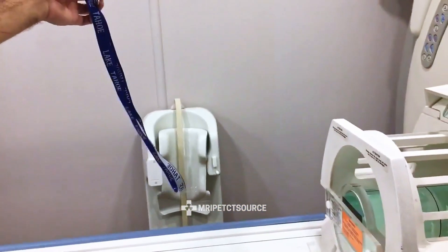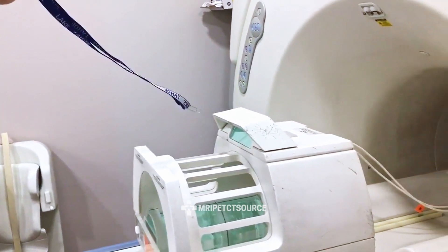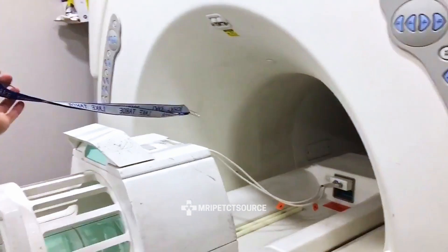Now we're starting to reach the head coil here. We're starting to see some pull at about four feet away from the magnet. Getting three feet from the magnet, two feet from the magnet, and that's pretty much as strong as it's going to get right at the edge of the bore there.